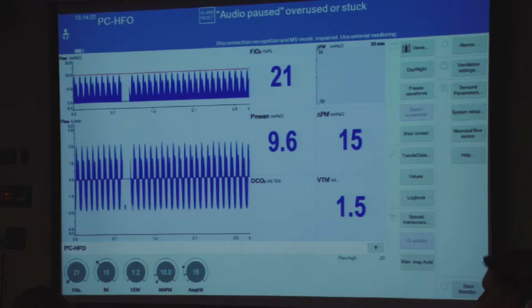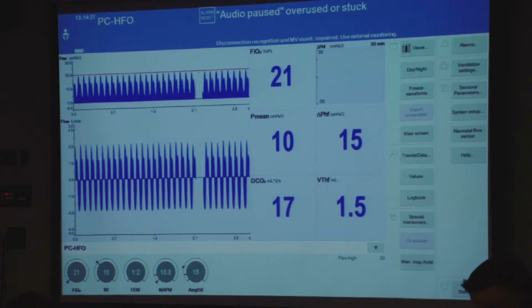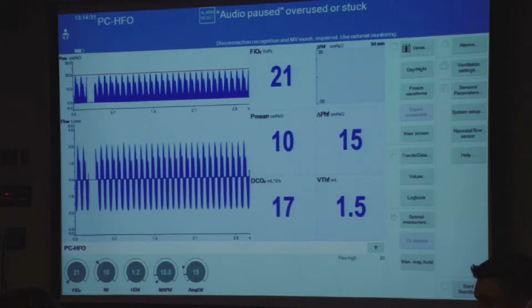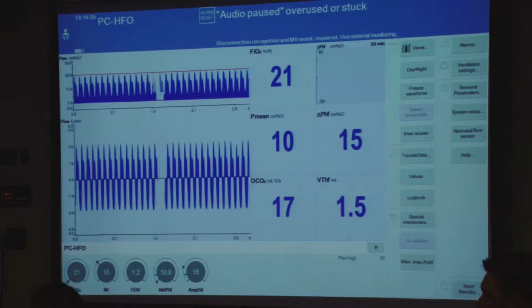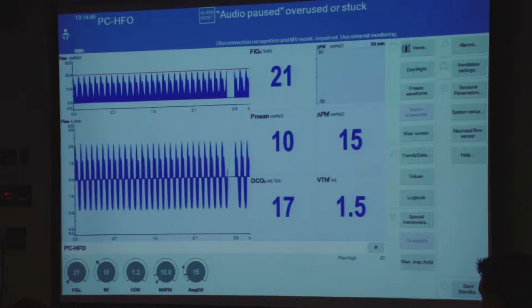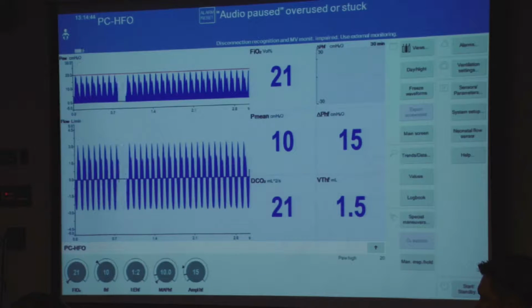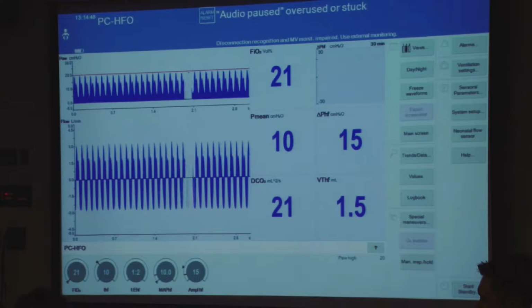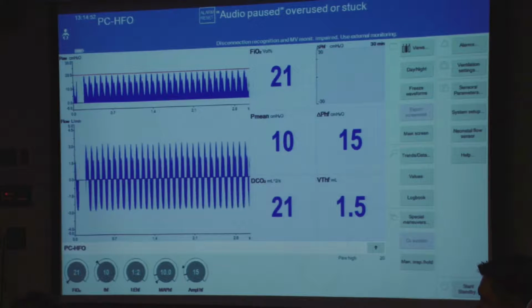it's very quiet. That's the first thing that stands out, because when you're used to the Sensormedics, which is quite noisy actually, this is amazingly quiet. We were talking about that before. In closed rooms, like you have bigger spaces. We have individual rooms, but they're much smaller than yours. So they act really like resonant boxes when you put a Sensormedics inside. So it's not very nice.